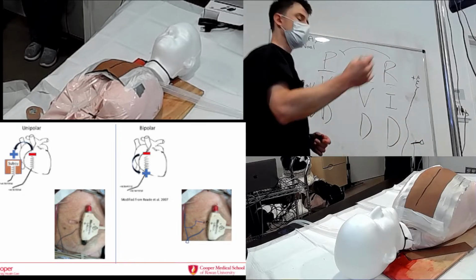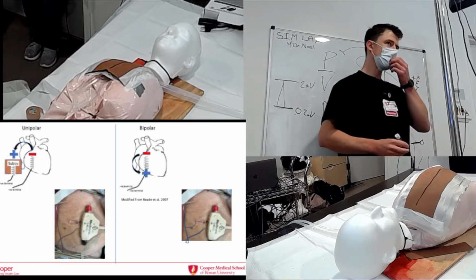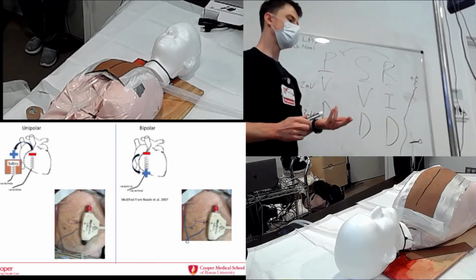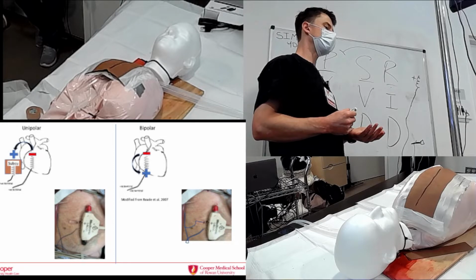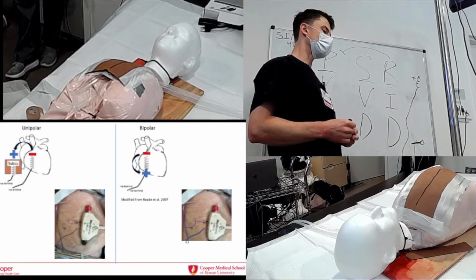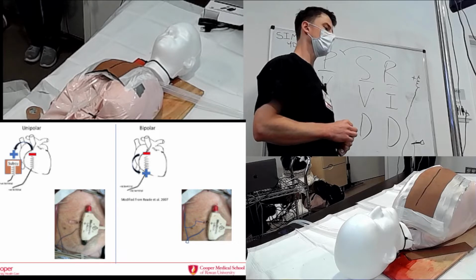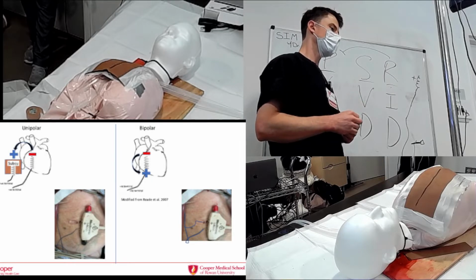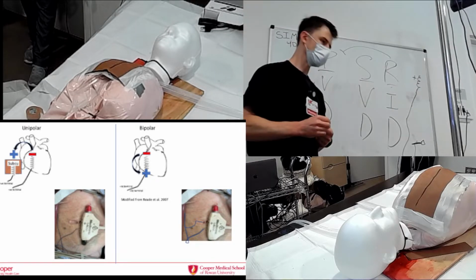Okay, so Tom, let's say you have a patient now that you didn't lose. Let's say they're being paced. They have underneath the paced rhythm of 80 a native rhythm that's a complete heart block with an escape rhythm in the 30s. Okay? And with that, they become hypotensive and symptomatic. So this patient now is losing capture and is very hypotensive. So how are you going to troubleshoot? So you already pushed the DOO. You're not getting capture. Okay. So what else can you do?